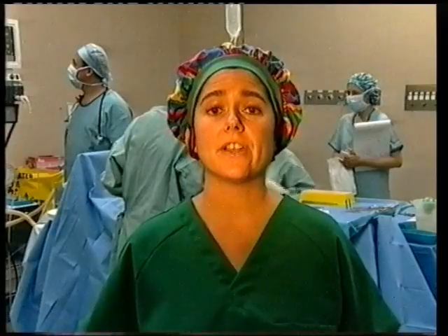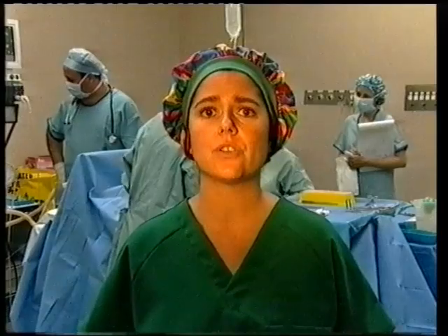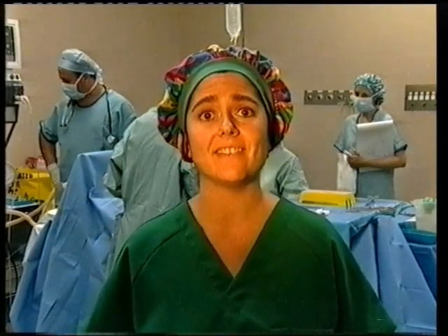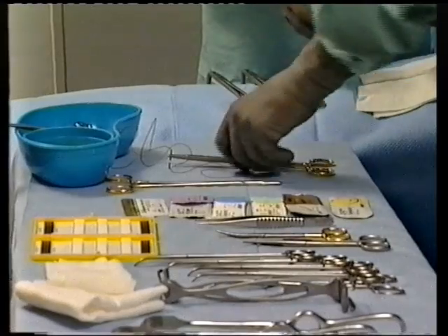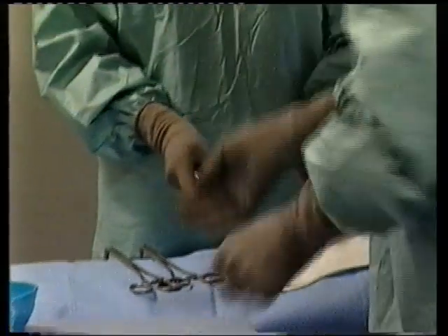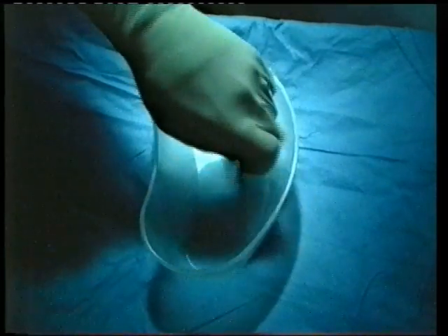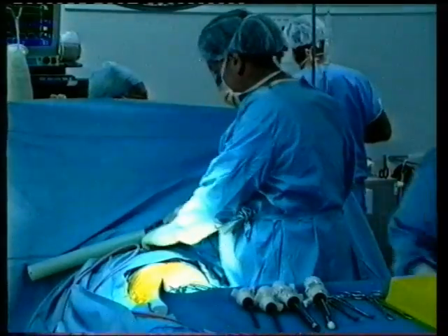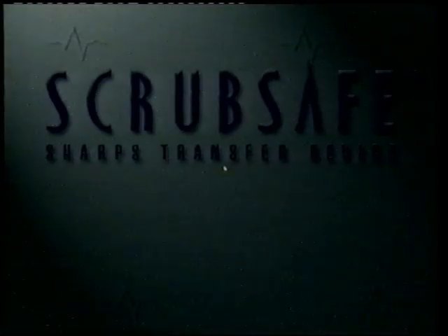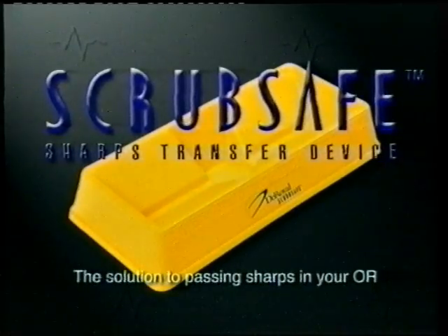Have you personally had a sharps injury in the OR yet? If you have, I'm going to show you how to avoid it happening to you again. The hand-passing of sharps between members of the scrub team during surgery remains an extremely dangerous practice for everyone. Now at last, the solution to safe sharps transfer for the entire scrub team is here, with the introduction of the ScrubSafe sharps transfer device from DeRoyal, the leaders in OR safety.